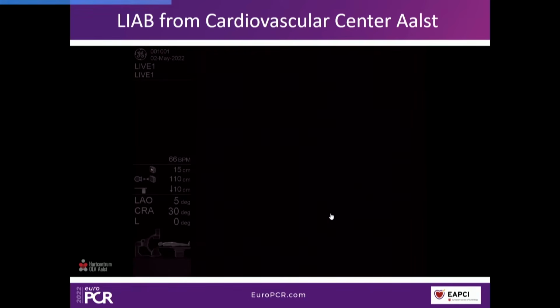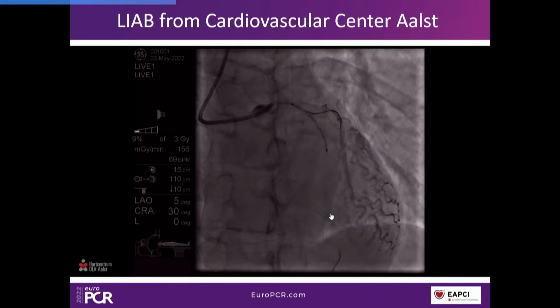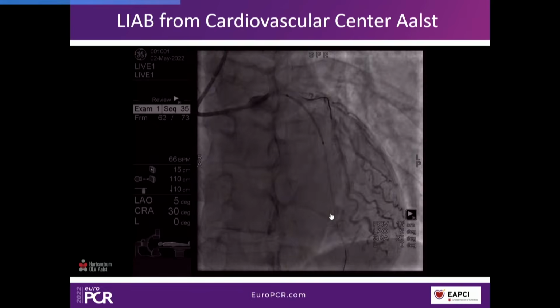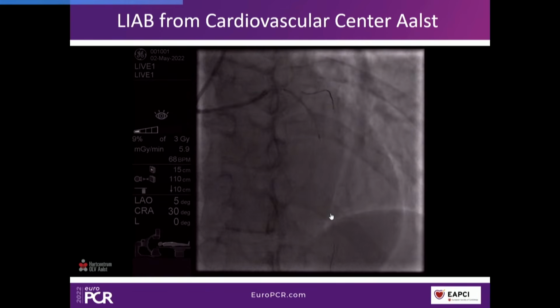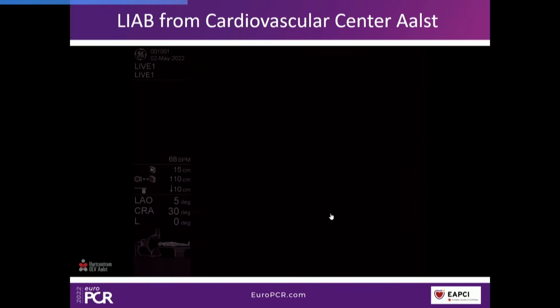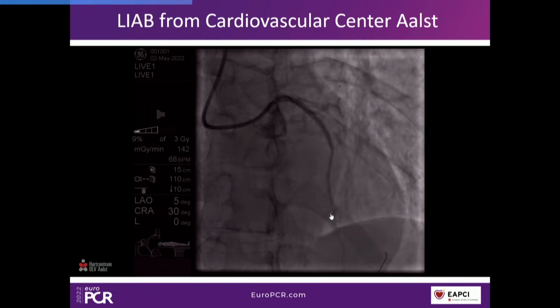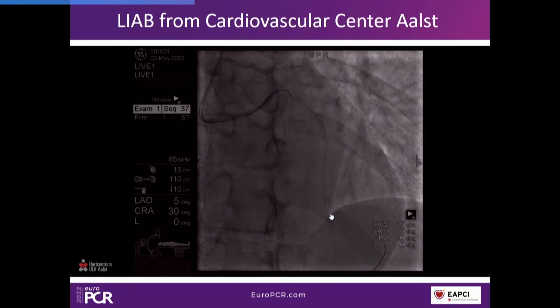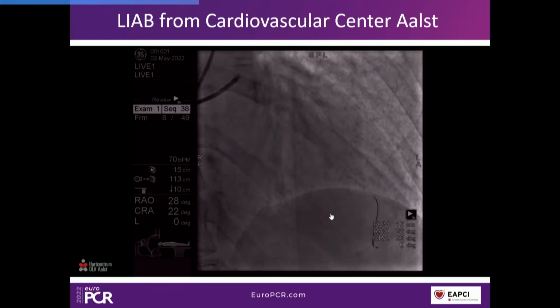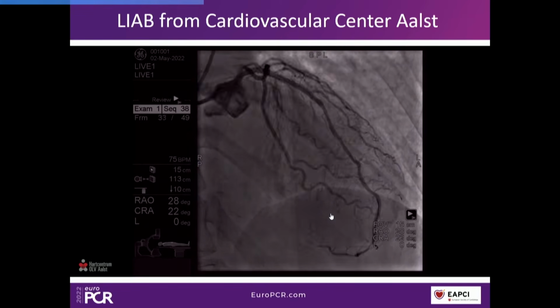Ready? 1 millimeter more. There. That's better, right? Yeah. Yes. Just got the distal lesion there. CFT. Okay, it's not too bad, huh? The one is not too bad. I would avoid to stent that one as well. Hopefully. Let's measure.